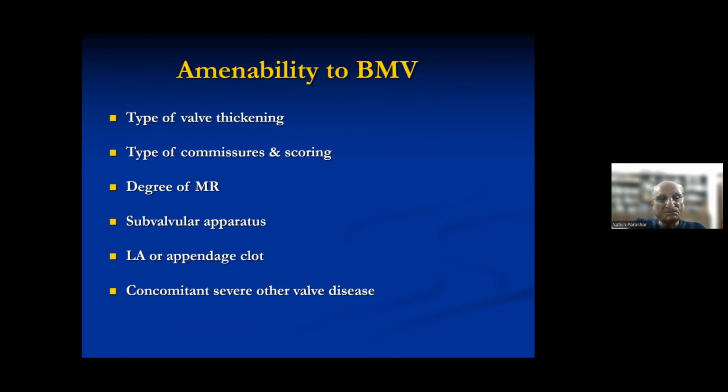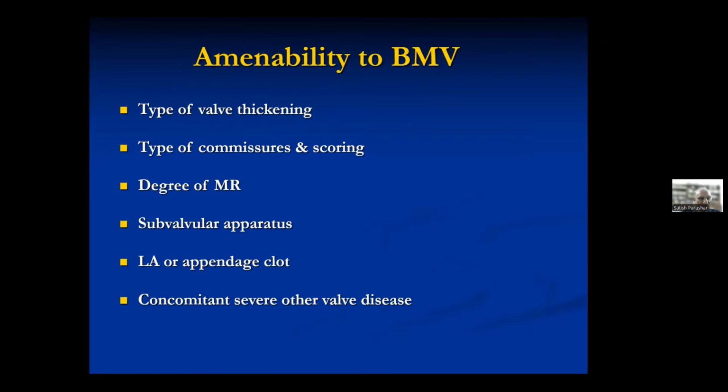So your aim is to give all information. If you can't give it, always mention the limitation of the study. If you are not able to give any information, please write that. If you are not able to give the MV orifice area, please write it. So just give that also.